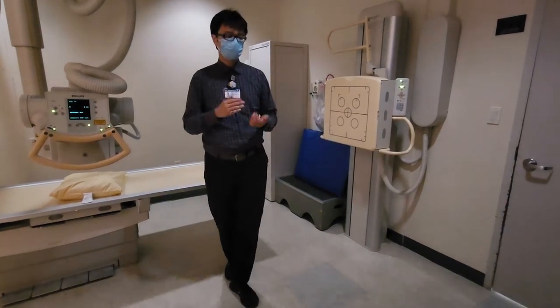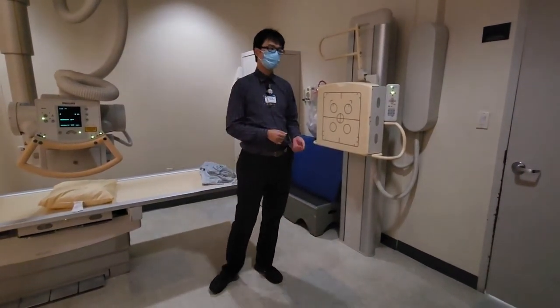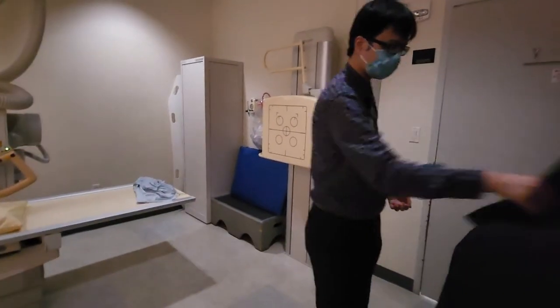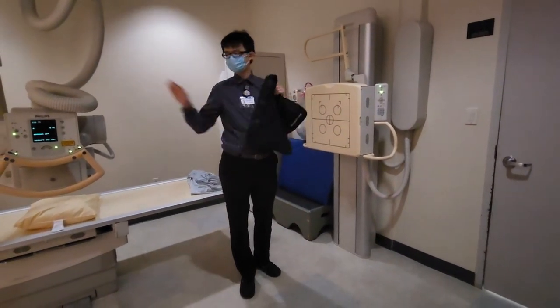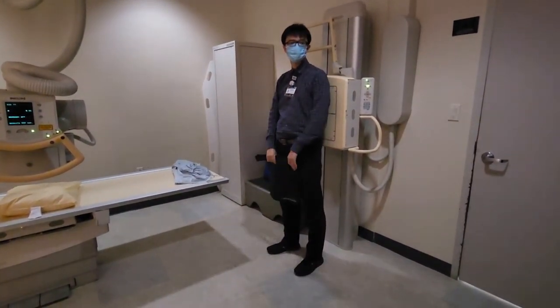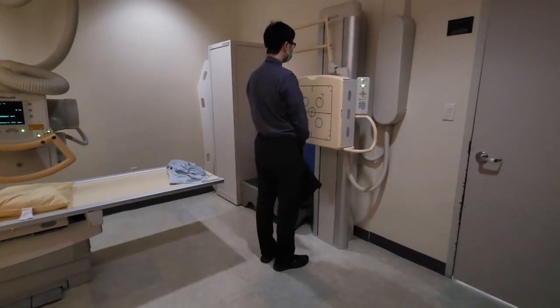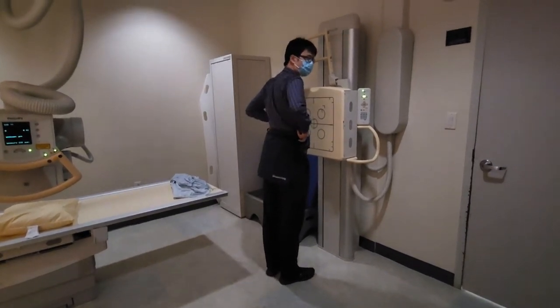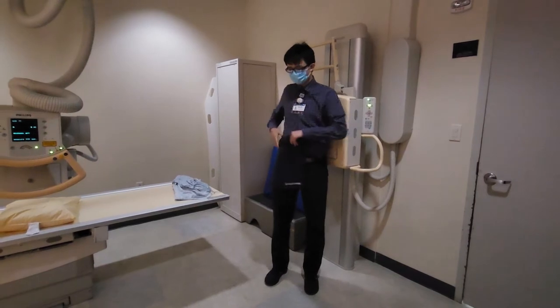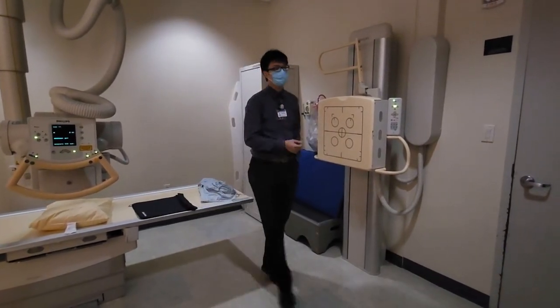I recommend making shielding part of your dressing routine. Once they come back in with their gown, you should immediately shield your patient. Remember: the shield always goes between the tube and the patient. For an AP projection, the shield should be in front. For a PA projection, the shield should be behind. For a lateral, the shield should be on the side. It should always be between the tube and the patient — do not forget to move it between each projection.